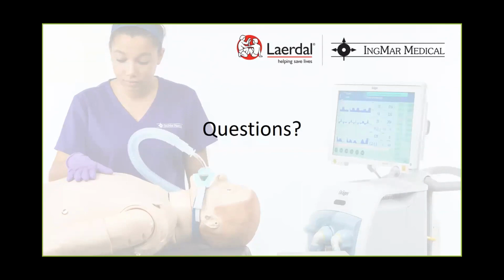Brian, I see one for you. Are we able to make and save our own simulations in the new software? So the new 5 cases that are in the IngMar software? Yeah, absolutely. So the newest feature we've added to the plugin allows customers to save their own patient models. So basically, they would be able to choose their own combination of resistance, compliance, and spontaneous effort, and then they can simply save these new models to create a patient library of their own.